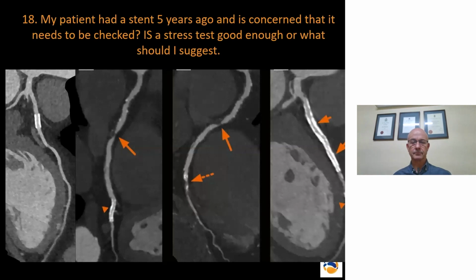So here's another question. My patient had a stent 5 years ago. He's concerned that it needs to be checked. What test can we do? Is a stress test good enough? I'll just show you what the CT coronary angiogram of a stent looks like.